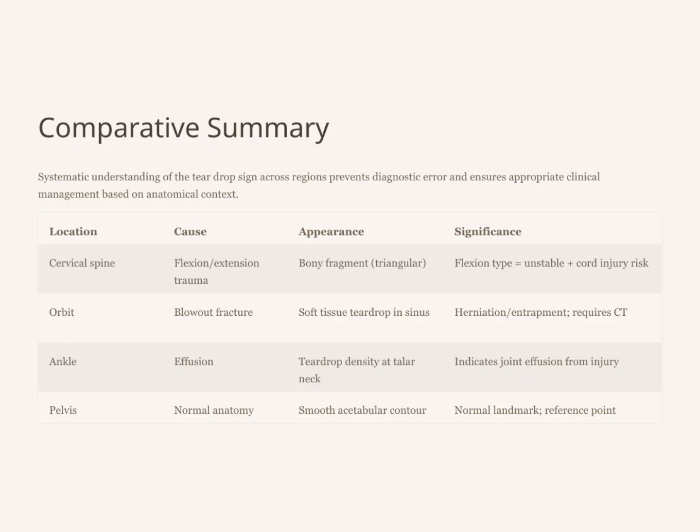Let's take a closer look at the comparative summary. This slide emphasizes the importance of a systematic understanding of the teardrop sign across different regions to prevent diagnostic errors and ensure appropriate clinical management, all based on the anatomical context.